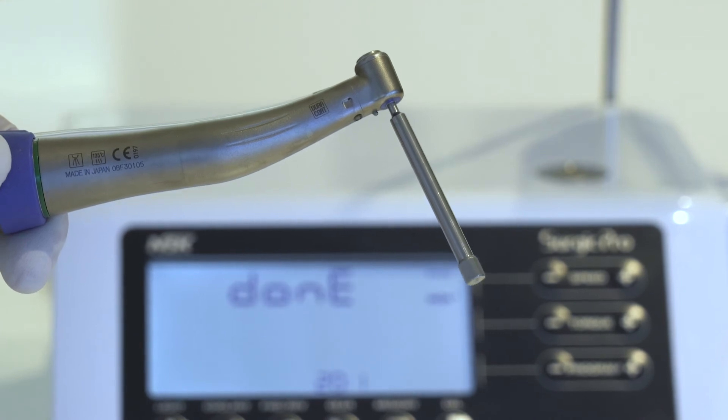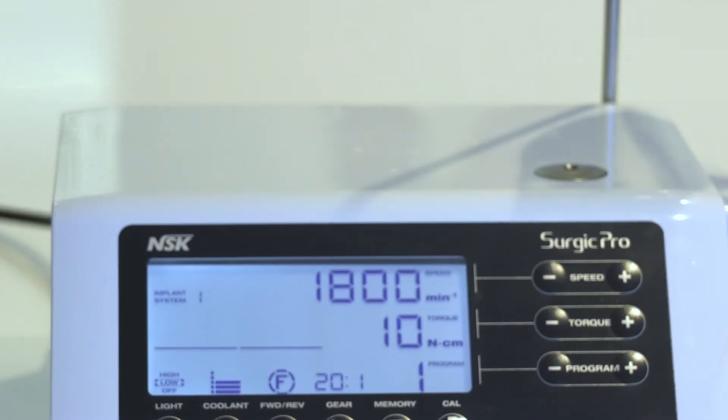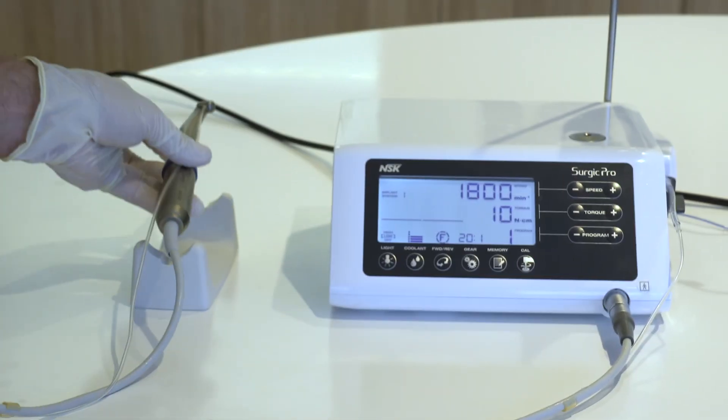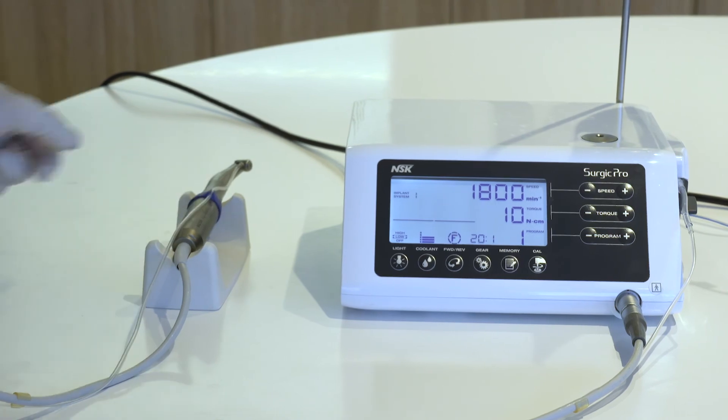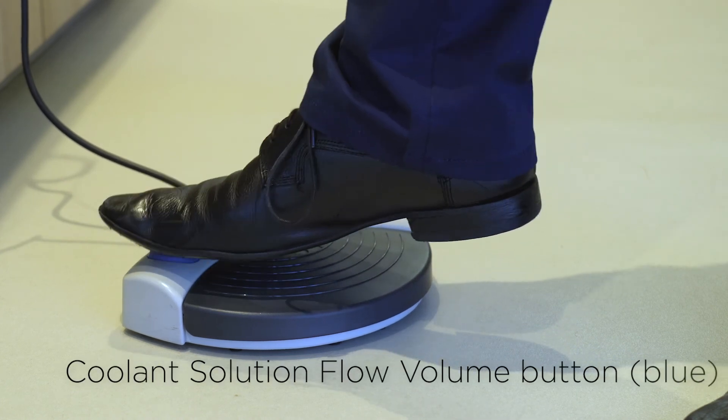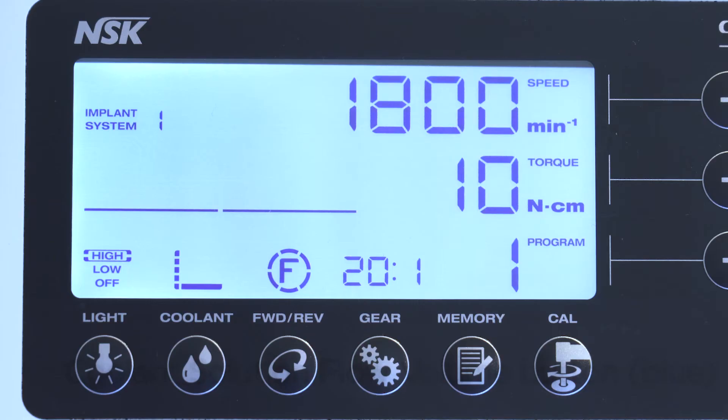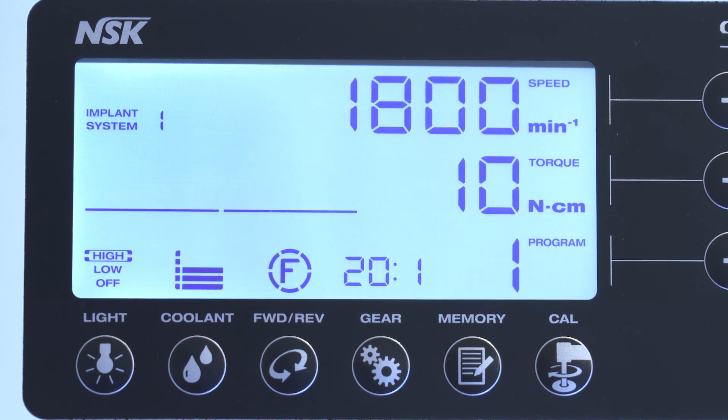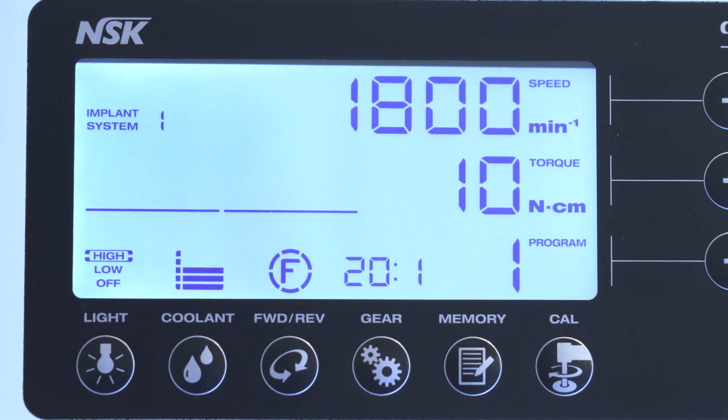Calibration mode will finish automatically and return to normal screen again. Coolant Solution Flow Volume Button Blue. Use to select 6 levels of coolant solution flow from 0 to 5. Each level may be increased by one step by pressing this button. If you press the button in level 5, it returns to 0.